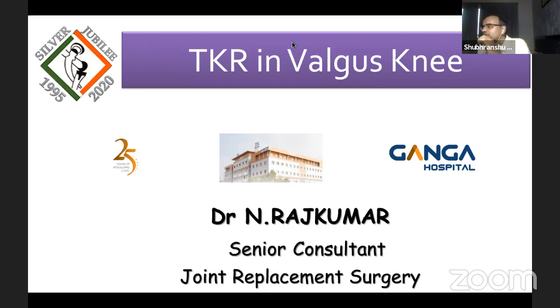Yeah, Anup, do you do CT scan for rotational? CT scan, yeah, we will do in cases in which we expect a rotational deformity. So there are cases of distal femur fracture, malunited in external rotation. There it is wise to do a CT scan to see where the actual epicondylar axis is, and with CAS to adjust to it. So it is indicated in post-traumatic cases, number one. Number two, sequence of release, I think we have discussed.